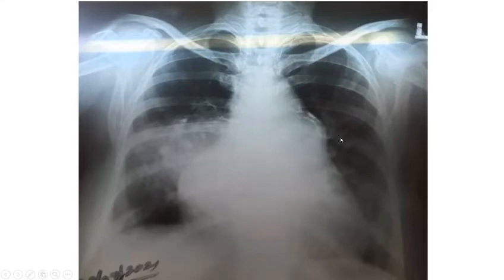So the peripheral vessels are completely cut off. You can see a huge right pulmonary artery. The left pulmonary artery is difficult to see because it is behind the heart. The right pulmonary artery you can easily make out. End-on vessels are seen. Peripheral cutoff is seen. All put together, the patient has evidence of severe pulmonary artery hypertension and a calcified ductus, which indicate that most likely it is a patent ductus arteriosus with Eisenmenger syndrome.